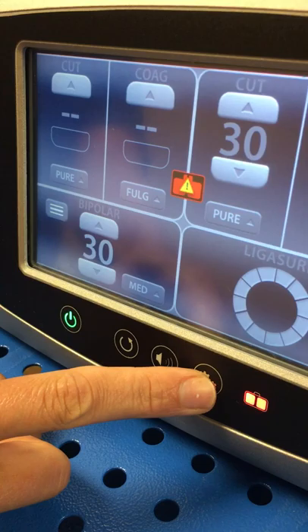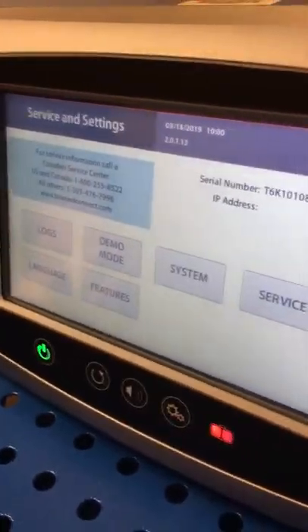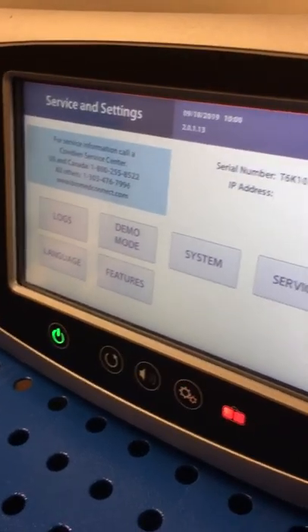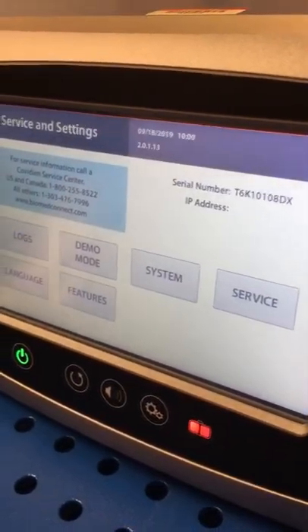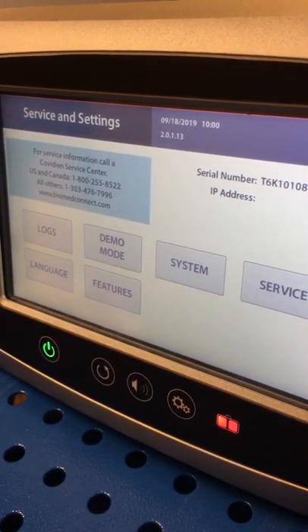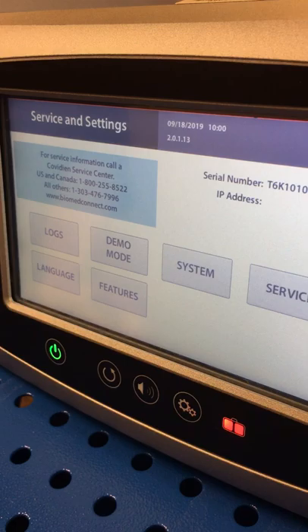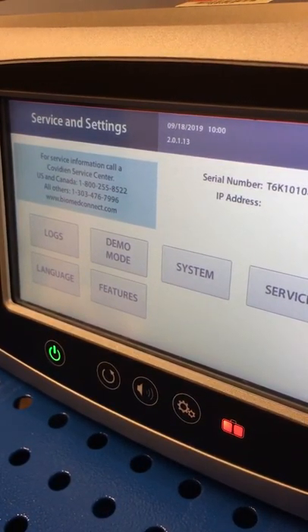This last button right here is a service and settings menu. This is used by me to do software upgrades, and also by the clinical engineering or biomed person here at the hospital to do PM checks. You really shouldn't have to get into this service and settings menu ever.